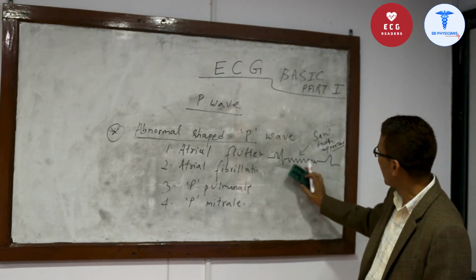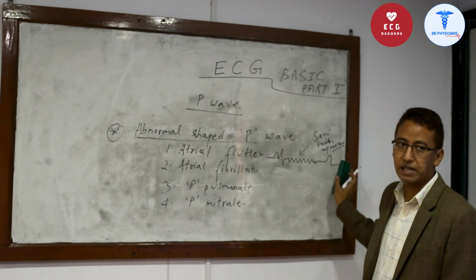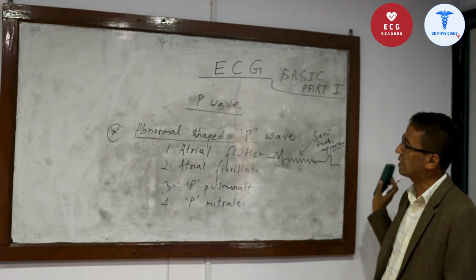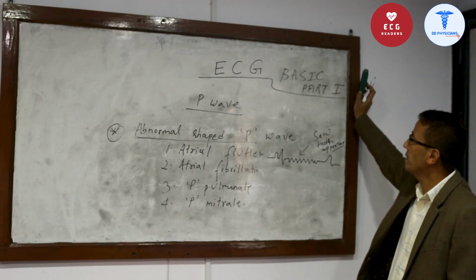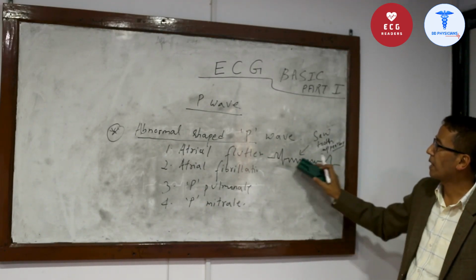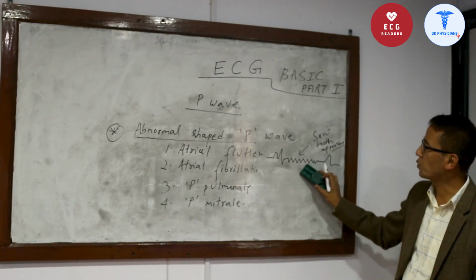In ECG, this is the only condition with a sawtooth appearance; other diseases do not show it. The ECG picture will be like that.